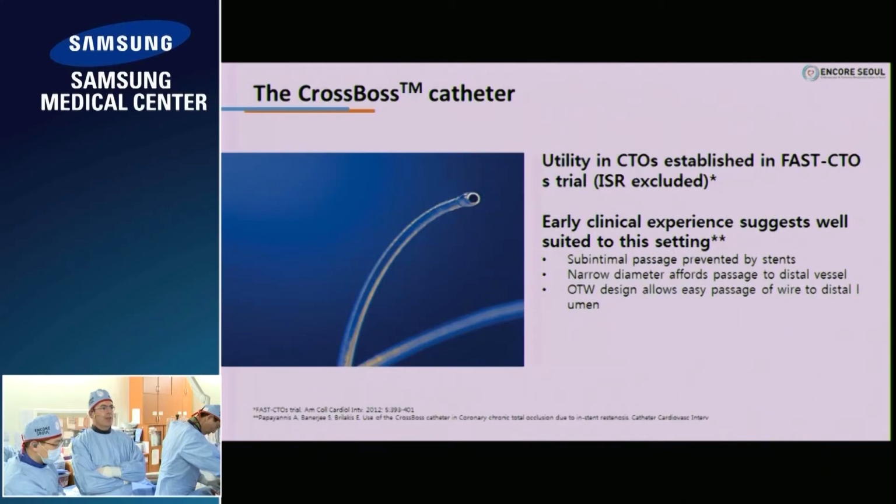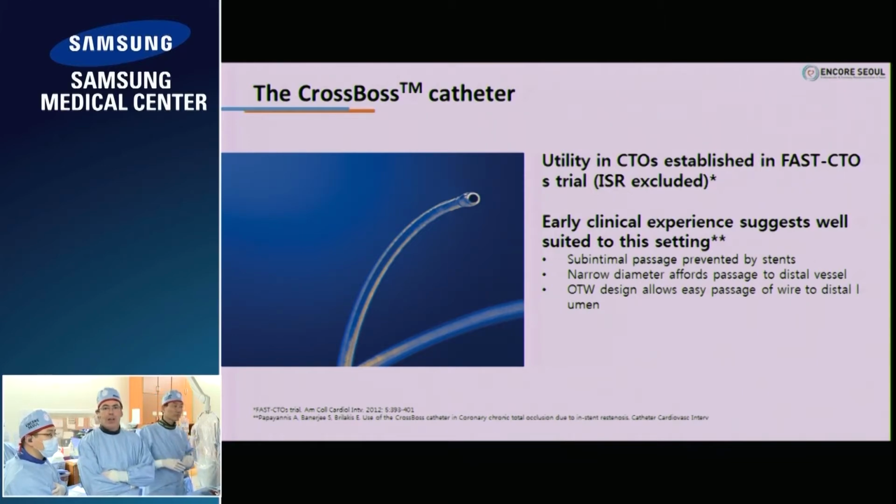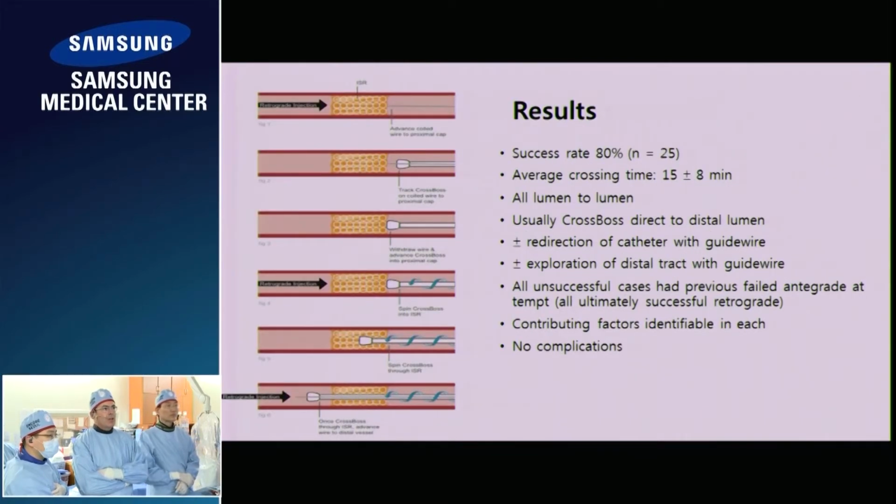In the FAST CTO study, which has been reported earlier in this meeting, these patients have not been studied. So we had a look systematically at a group of these patients with our early experience. We had an 80% success rate with 25 patients.